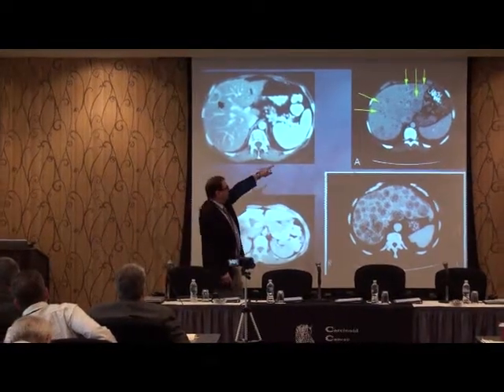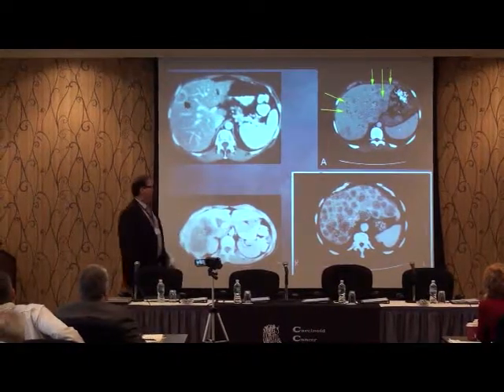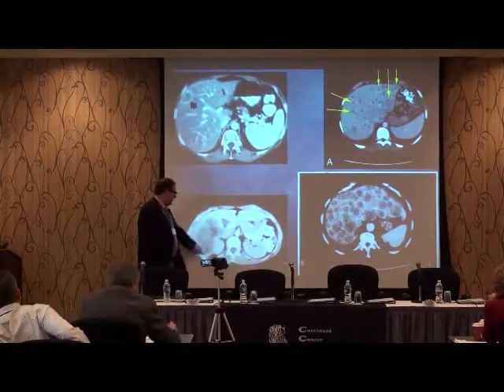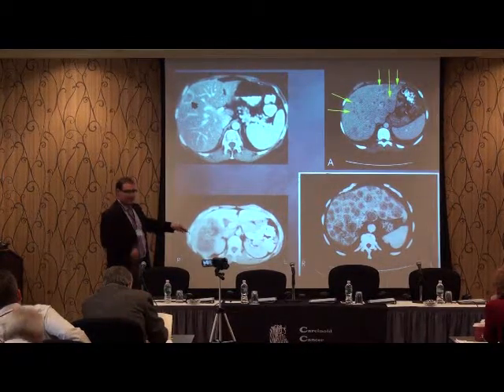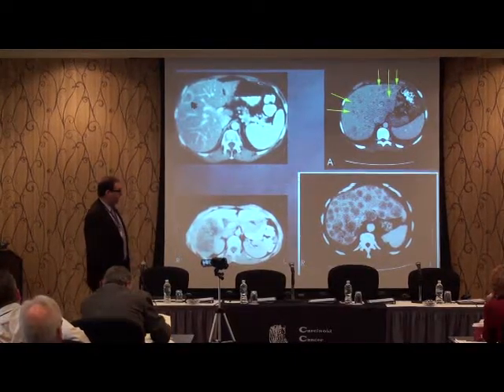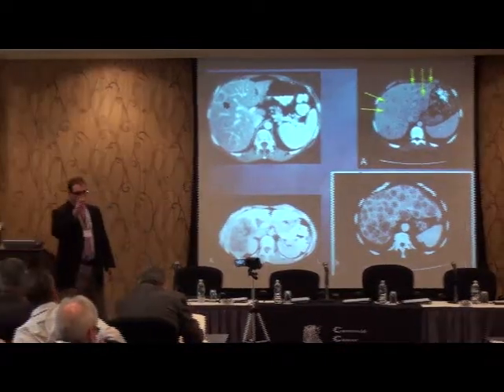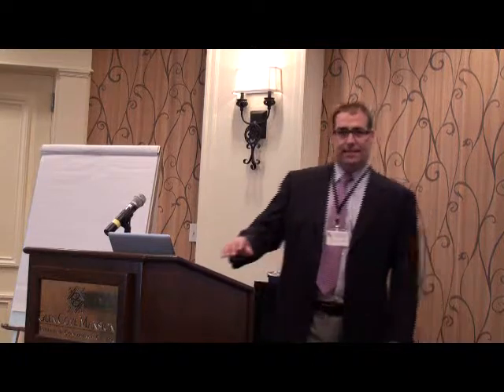This is a little bit more advanced. There's multiple small liver tumors in that image. Here there's a very large dominant tumor. That's very advanced. It's taken up a large portion of the liver, as is the bottom image with multiple what we call cannonball type lesions throughout, multifocal diffuse disease throughout the liver.